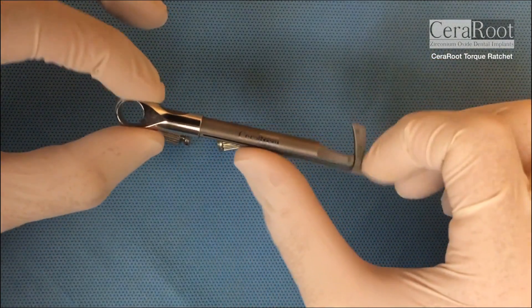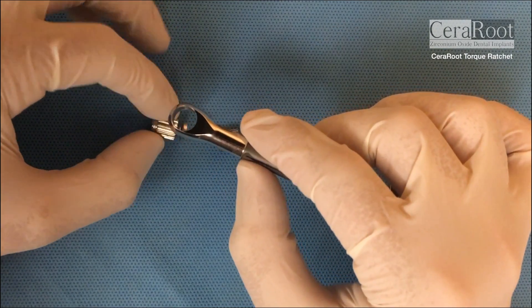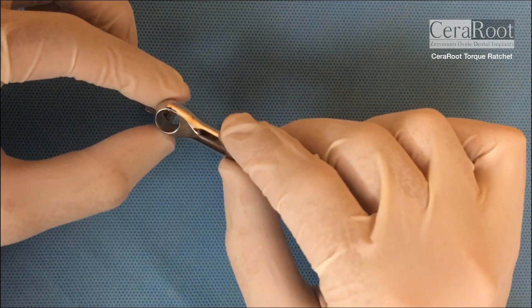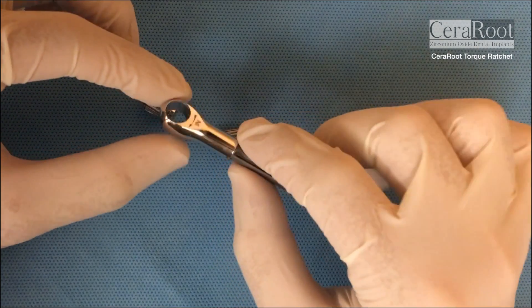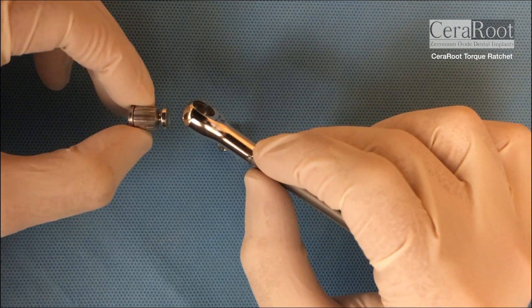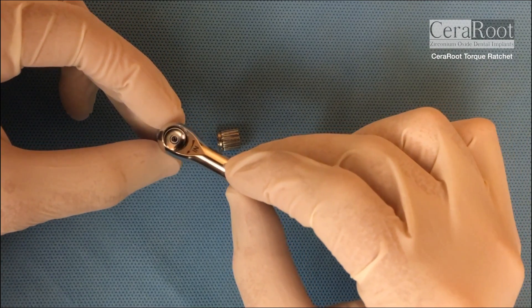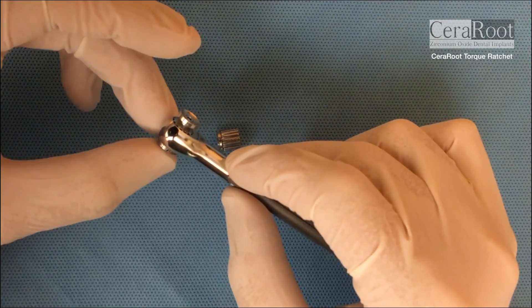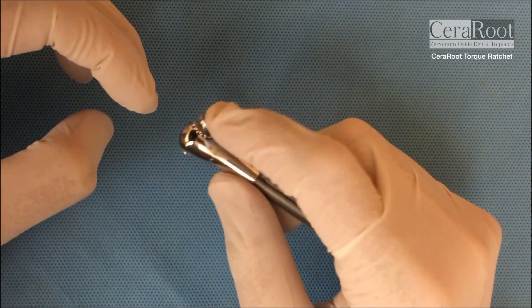When you want to wrench the implant and screw it into the socket, you're gonna see the word IN always. If you see the word OUT while you are screwing in, then it's not gonna work — you have to see the word IN. You're gonna bring the thumbwheel from below like this and slowly it's gonna fit inside until you hear a click, so it doesn't fall off.